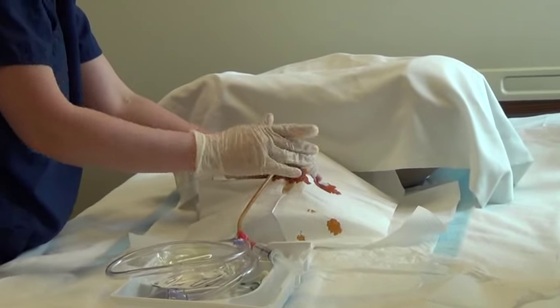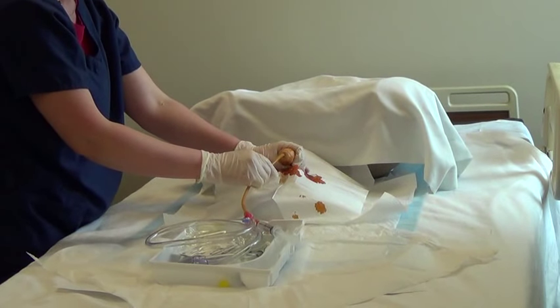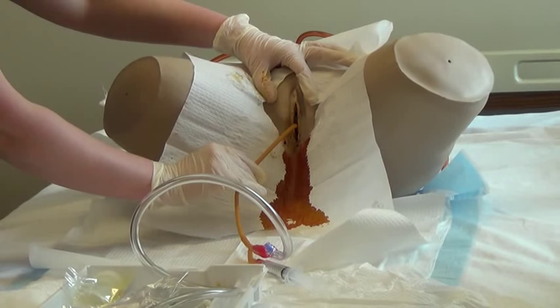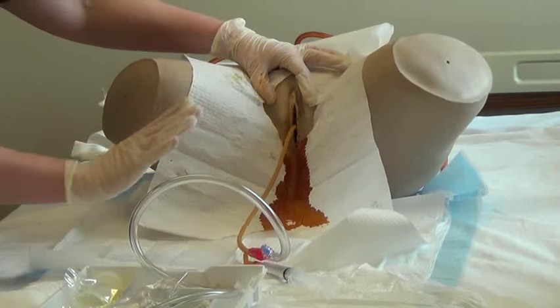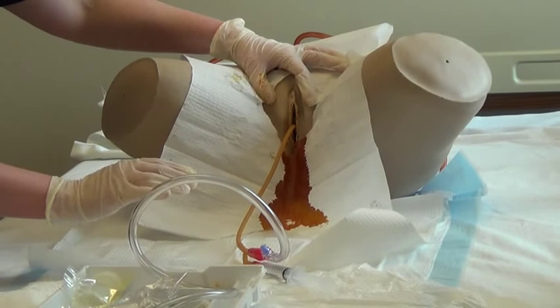Remember to use the code phrase, "Katie, let me get you another kit," to alert the inserter that there was a break in the aseptic technique. If the catheter is inadvertently inserted into the vagina, leave it there as a landmark. Then begin the procedure over, again using new supplies.